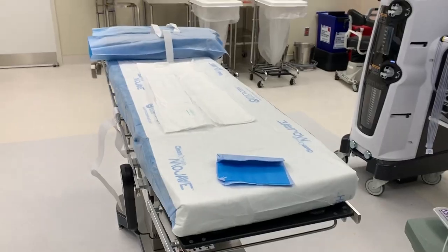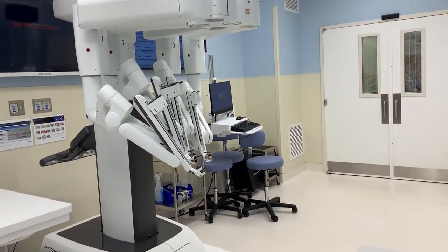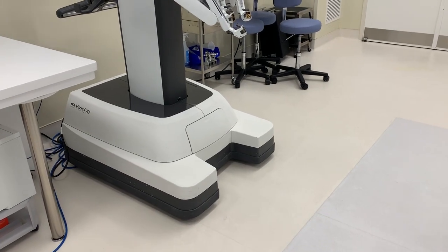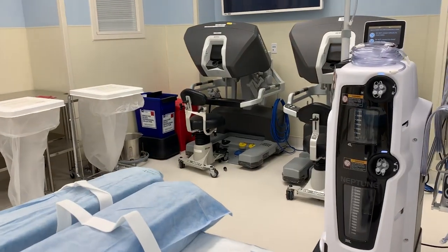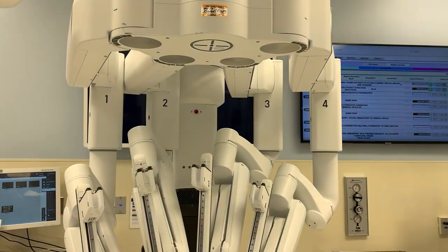Of course, the bed for the patient to lie on. This room actually has what we call the Da Vinci robot. And this is one of our really cool features that we use for lots of surgeries now. It's remotely controlled. There's some consoles over here that the surgeons will sit at and do cases. So it's pretty cool. It's pretty state-of-the-art technology.